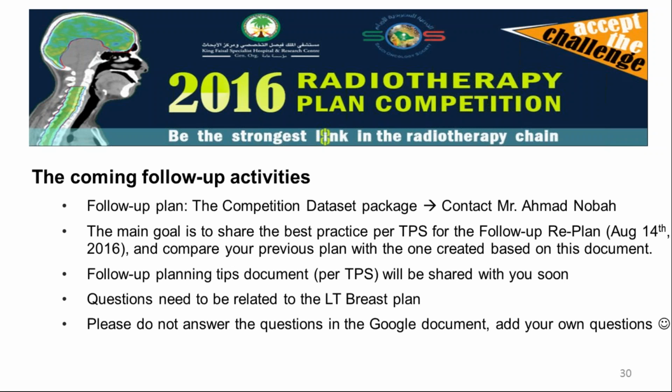We would like these questions to focus on the left breast plan, not general questions, but if you have any general question, we will try our best to answer it too.